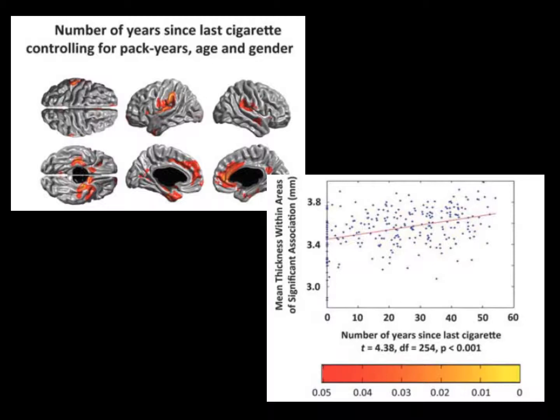Now, this is just one example of how one can use a standard anatomical brain image to explore regional brain anatomy. Although the two techniques outlined in this video are relatively crude in nature, they provide a great starting point, following which one can use other brain imaging techniques to obtain more specific information about the underlying cellular changes in various brain regions.